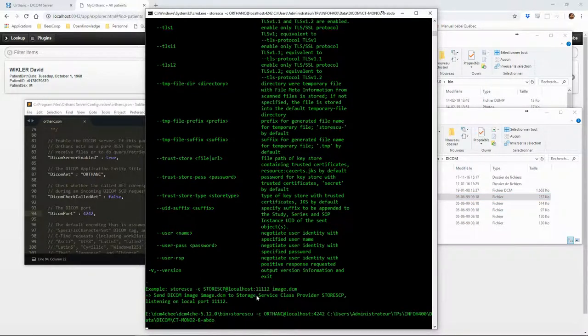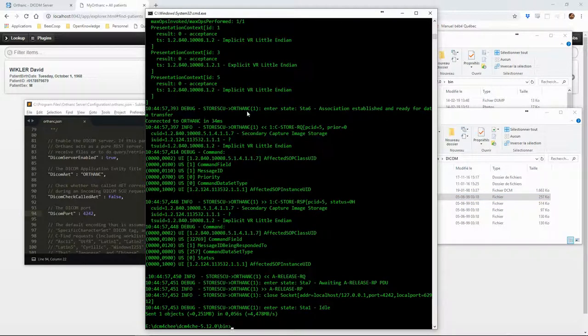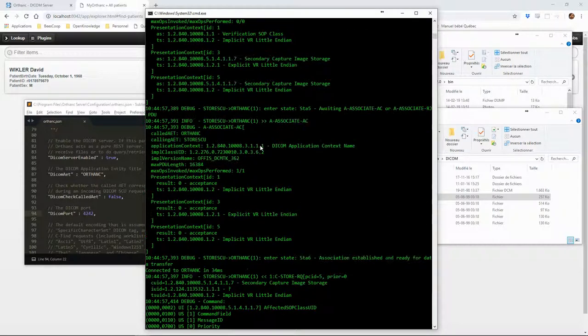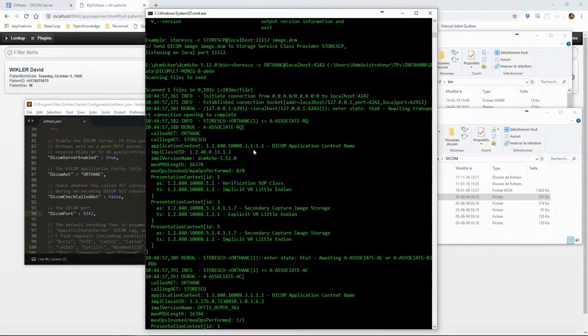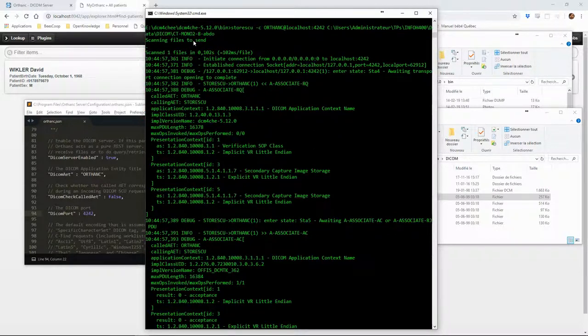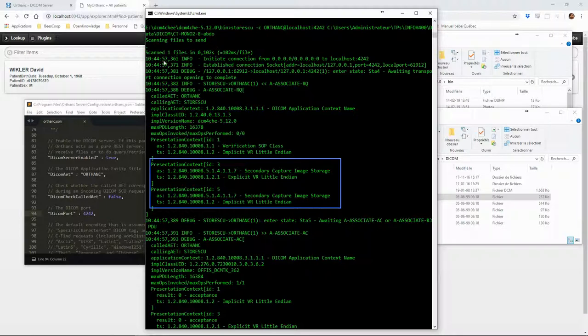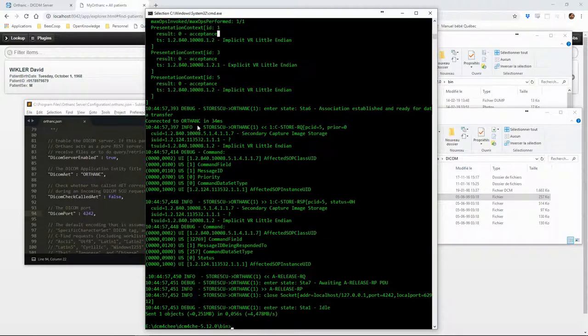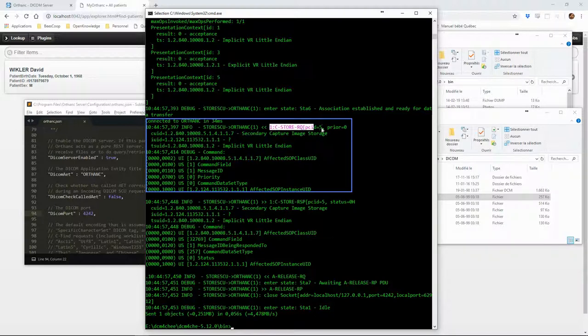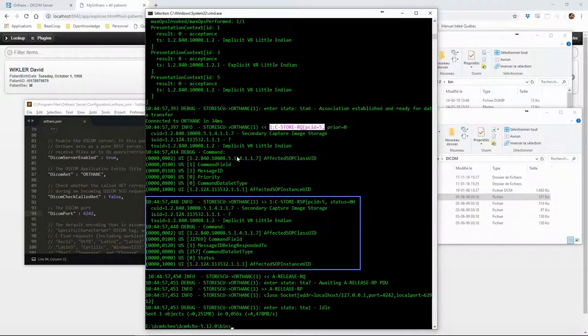The exchange visible on the command line is very similar to the C echo, except that the presentation context now contains another SOP class, the secondary capture image storage. The associate exchange is followed by the C store request and response, then the release.